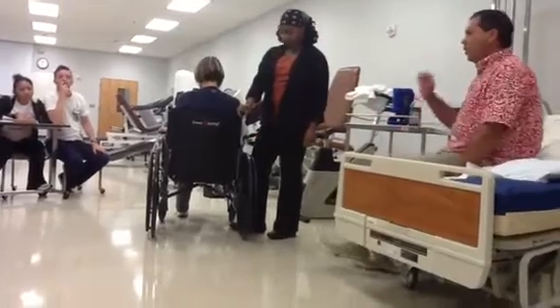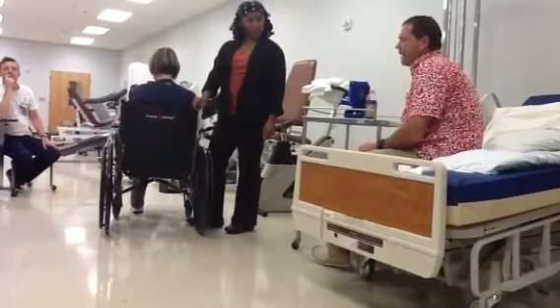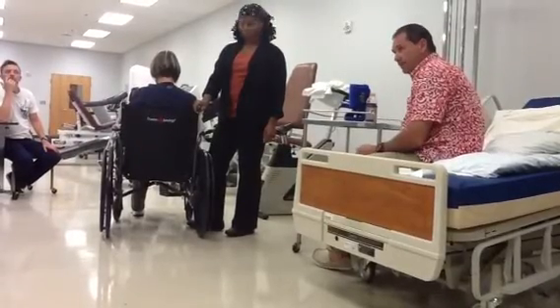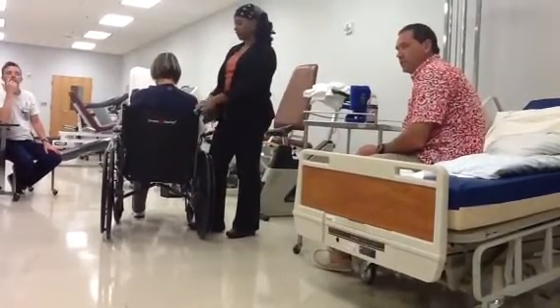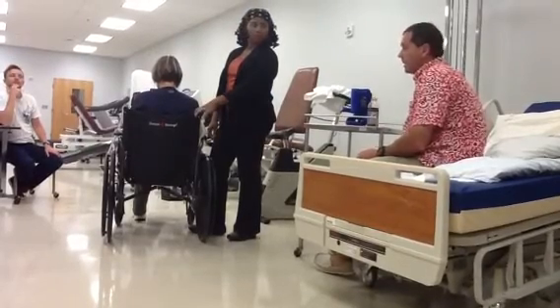So, looking at that, would you think it's a little bit too high, a little bit too low, or just right? Too high. Why too high? Too much support. I think it's too much support. I wouldn't be crazy about that. You've got to take what you've got.